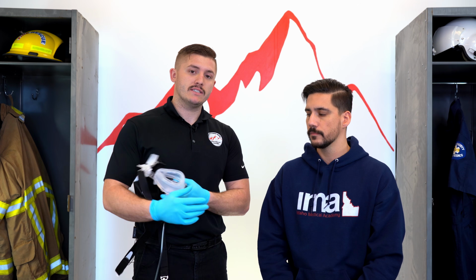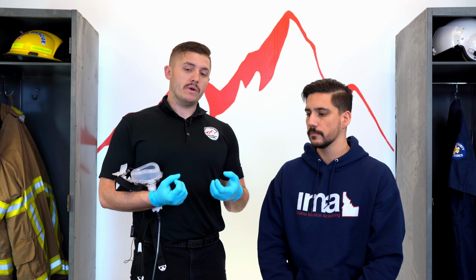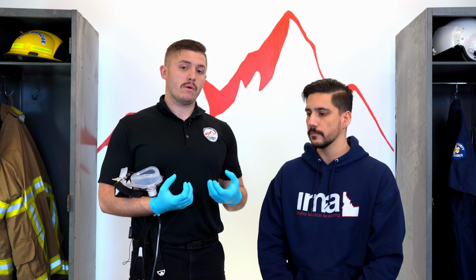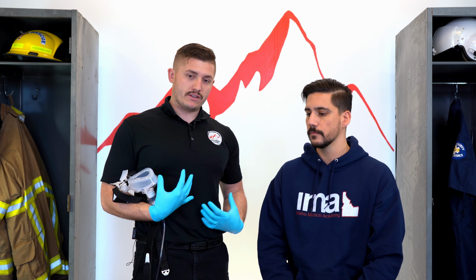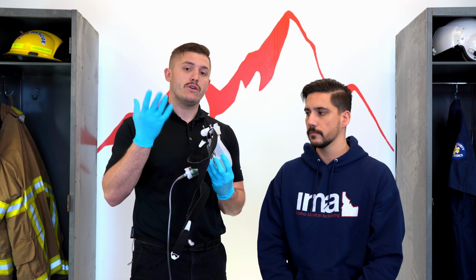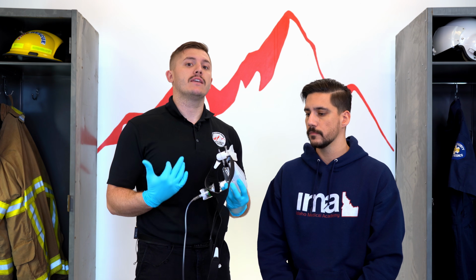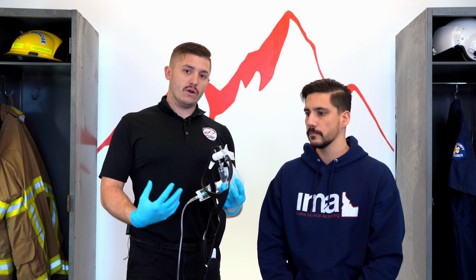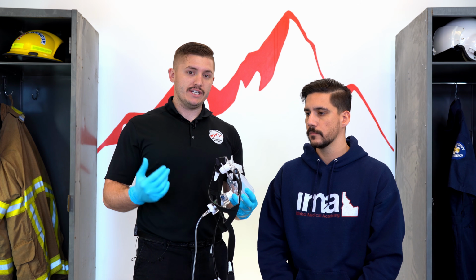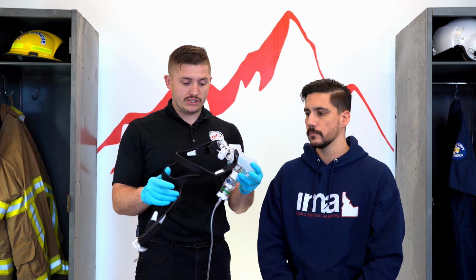So what CPAP does is, at the bottom of our lungs, we have our alveoli, correct? When we take a breath, we might have so much fluid or we might not be strong enough to get a breath to the bottom of our lungs. So what this does is it takes the breath that you're already taking and just pushes pressure into your breath to make it easier to take a full breath. And it actually allows that alveoli to get the oxygen it needs and have that gas exchange. So this is just placing pressure.